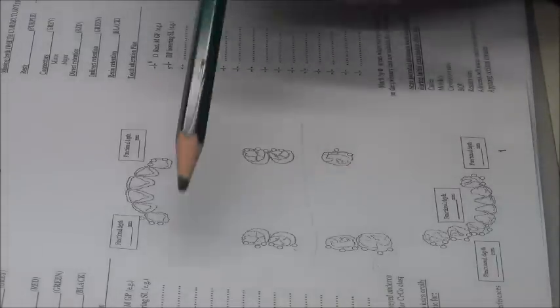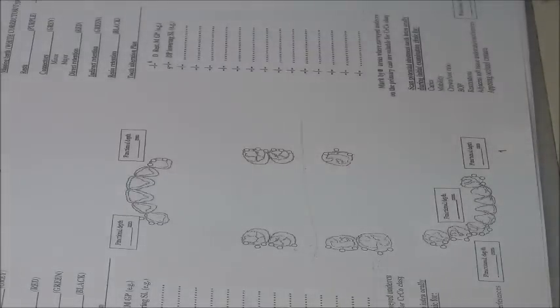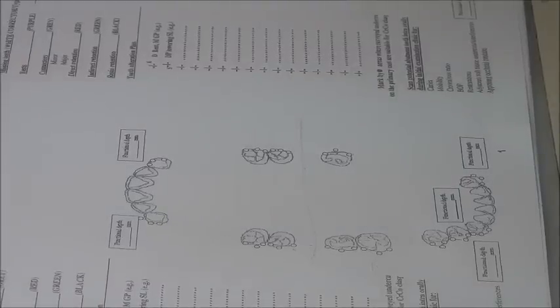Do I have to change my design here? Even if everything is favorable, sulcus depth is favorable, all teeth have no mobility, all teeth are healthy, nothing there, no tissue undercuts, nothing. There is nothing on the cast. Can I keep my circumferential clasp design on the bounded? Why do I have to change here?